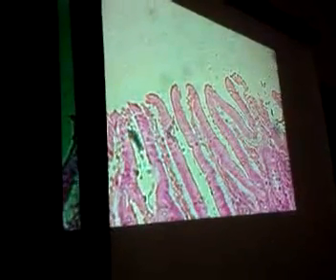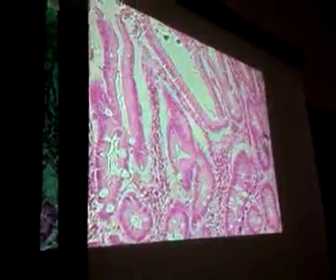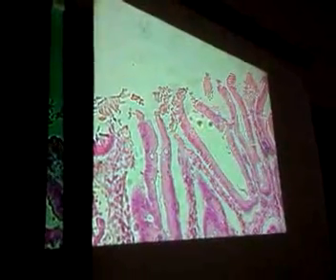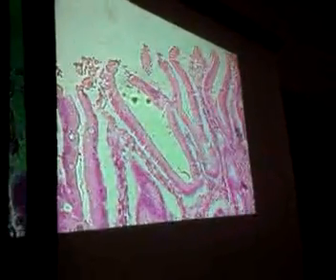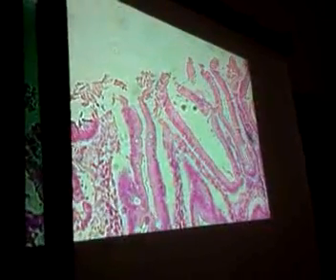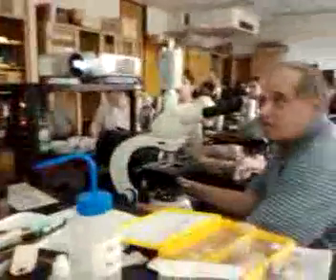And this slide did show some good. All right, what's one thing we look for? If you had to guess about these white things, what would you think they are? What'd you say? Goblets. Goblets, right. Goblet cells.